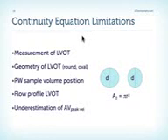And finally, it's very important to remember to use several windows to get the highest AV peak velocity, so that we don't underestimate the velocity and get a wrong, in this case, too high aortic valve area.